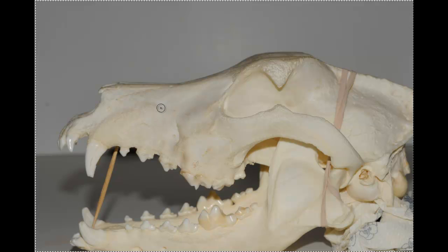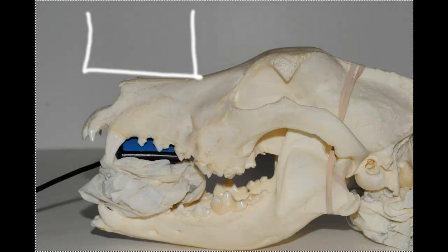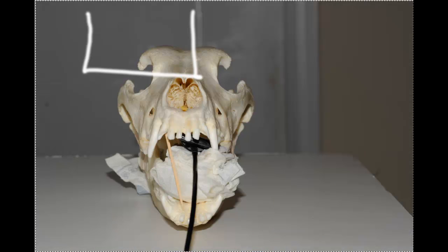So I would suggest bringing the x-ray straight down vertical as viewed from the side. So vertical to the muzzle as viewed from the side. Now when we put the sensor in place, in an ideal world, the sensor, with us being in sternal recumbency here, would normally be horizontal. But that's very difficult, if not impossible, to always achieve. So we're at a bit of an angle off of horizontal like that.